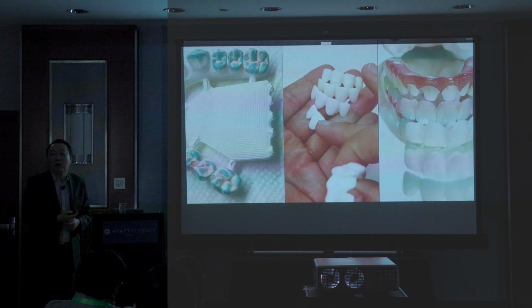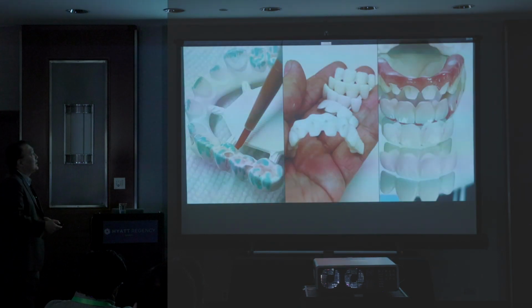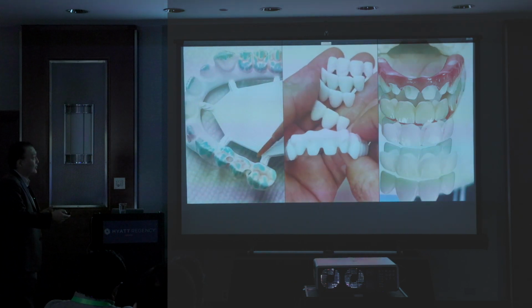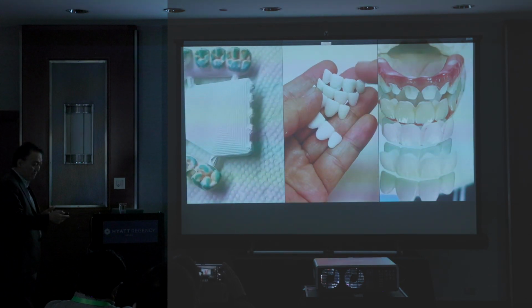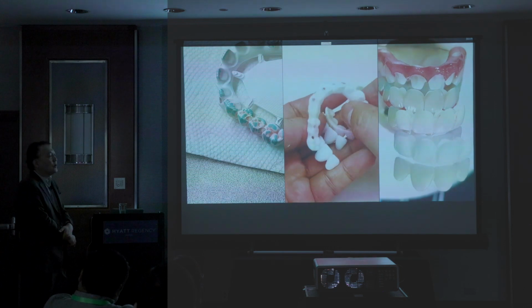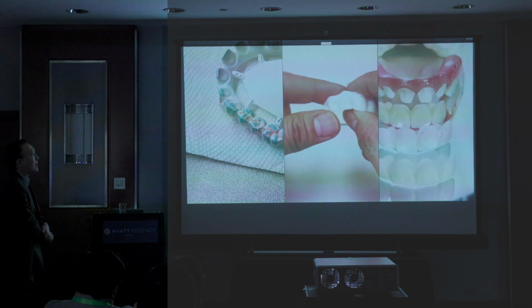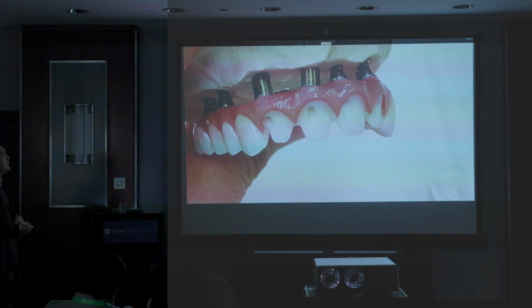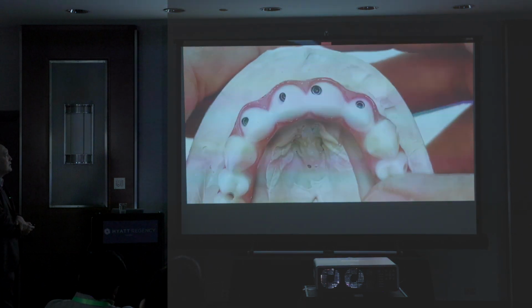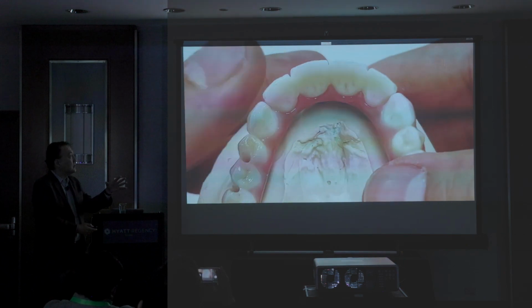Usually I do. No, we made a mistake. Sorry. So I want to get a good natural, I mean the proper contour and also value. That's what we made the four. So here is what it looks like. So what is the doctor going to do? They can use temporary cement on top of that. Okay. That was another design. Then we can give them another solution, eventually one piece. Okay, it's like this.